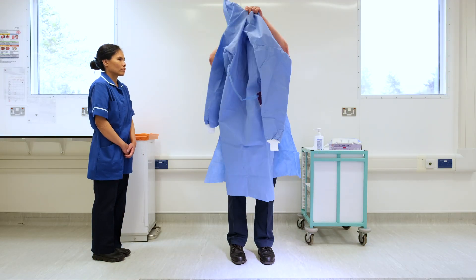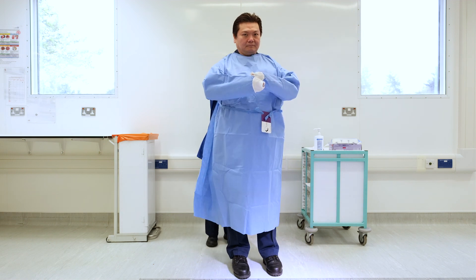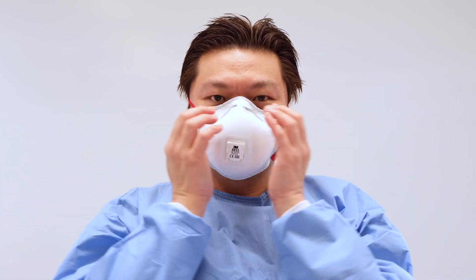Put on a gown that is the appropriate size for you. Your buddy will help in tying the back ties. Next, put on the FFP3 mask. Ensure this is the model of mask you have been fit tested with. Perform a fit check.